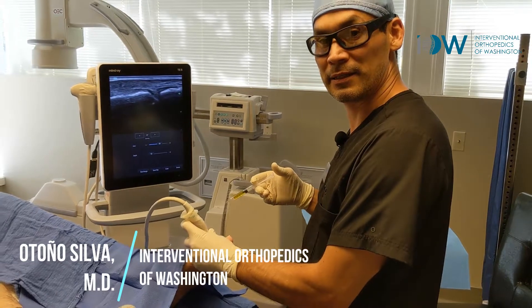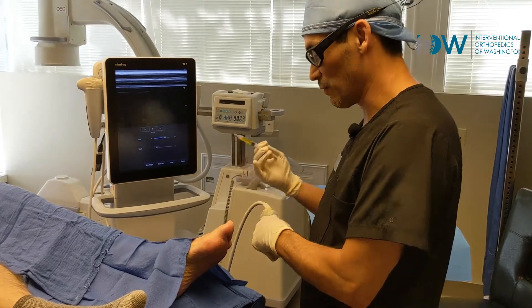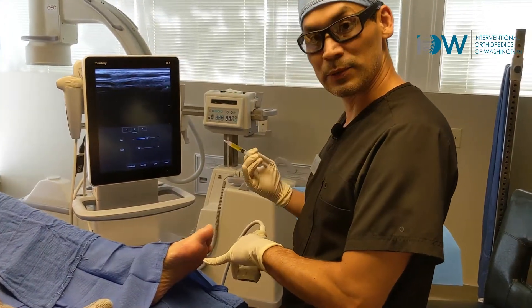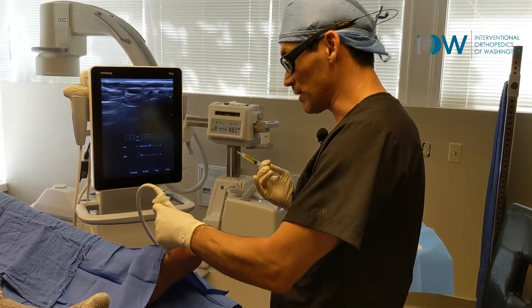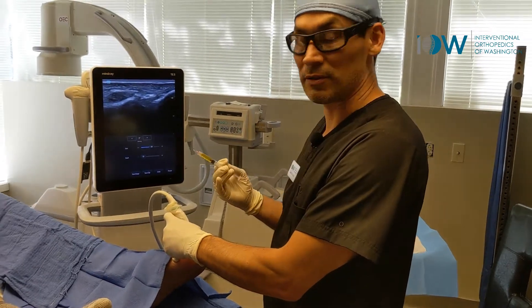We have a patient here with pain in his first big toe and as you can see there's slight valgus deformity. There's been a little bit of pain in the plantar plate which we just injected with PRP, and we're about to address the capsule because that's how this toe is going to work better overall.